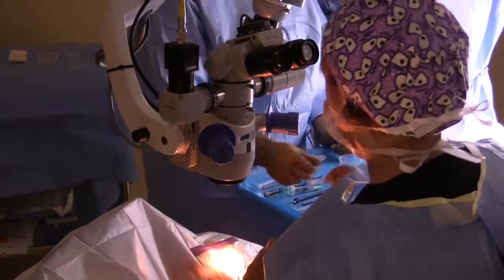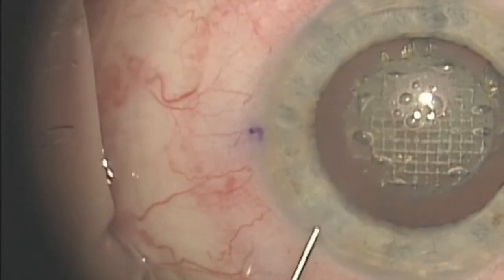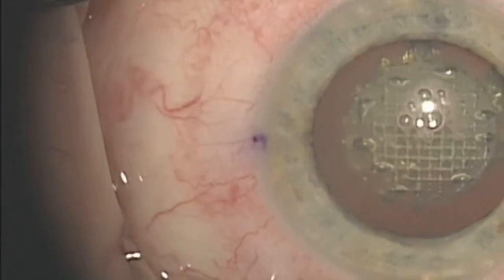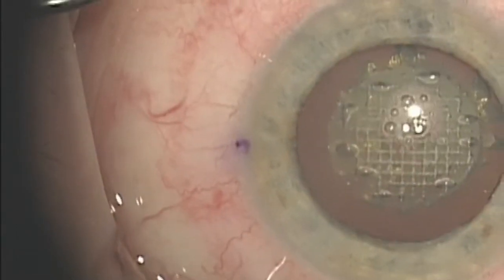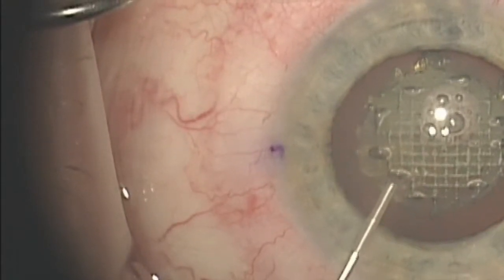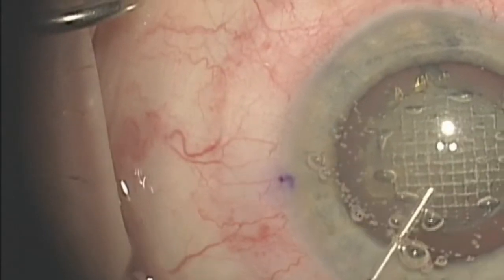That having been said, now this is the part that may sting this round. This is where we're numbing the eye. If you notice, we haven't used any needles other than her IV, but this just numbs it. That's a little teeny sting. That's all that she will really feel, because this is keeping her nice and comfortable with a little happy juice.